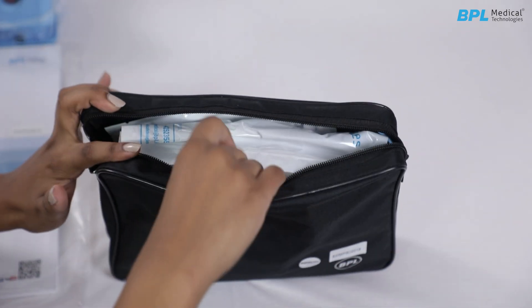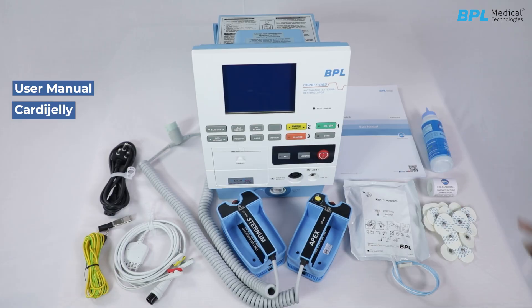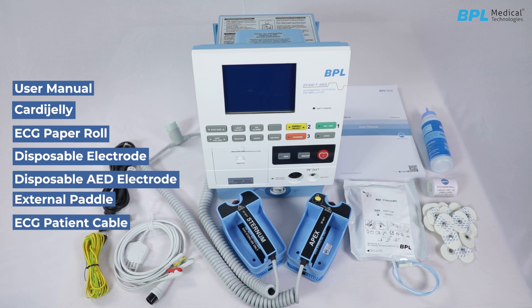The standard accessories provided with the machine include: user manual, cardiac jelly, ECG paper roll, disposable electrode, disposable AED electrode, external paddle, ECG patient cable 3-lead, earthing cable, and a power cord.